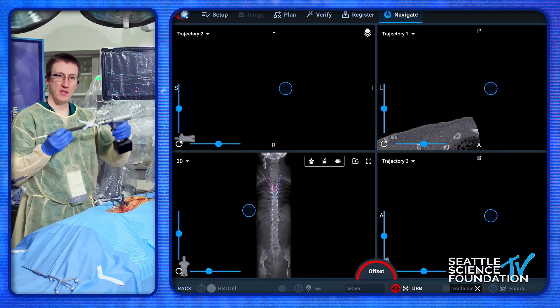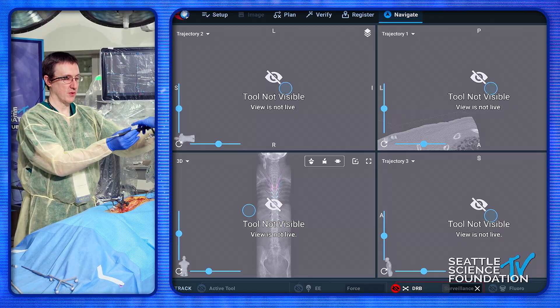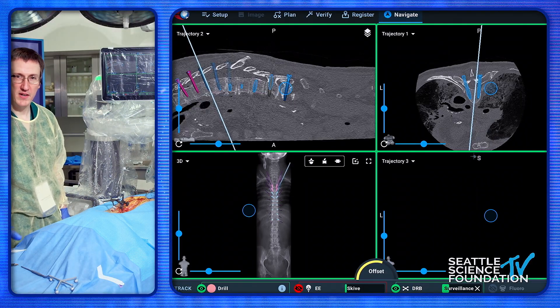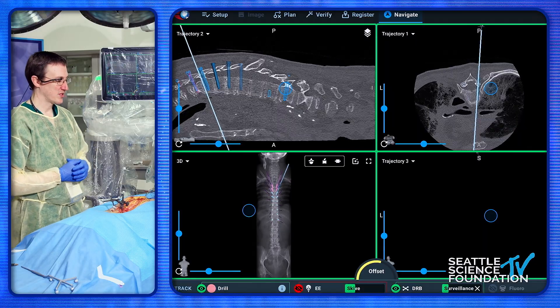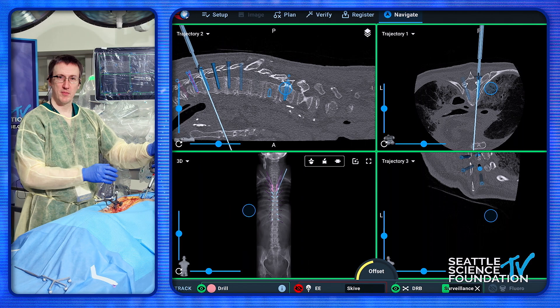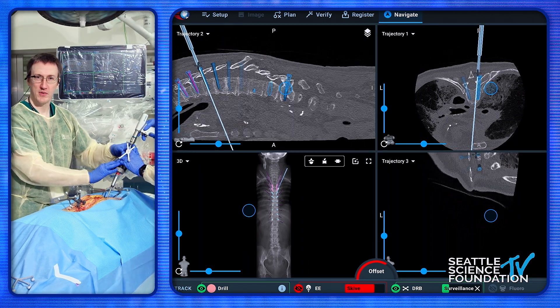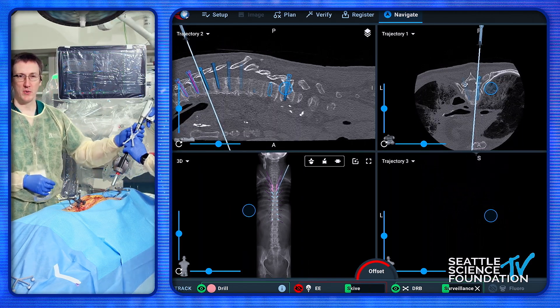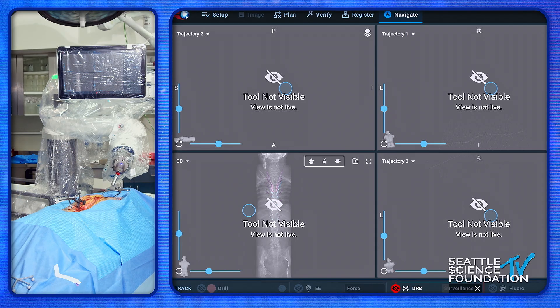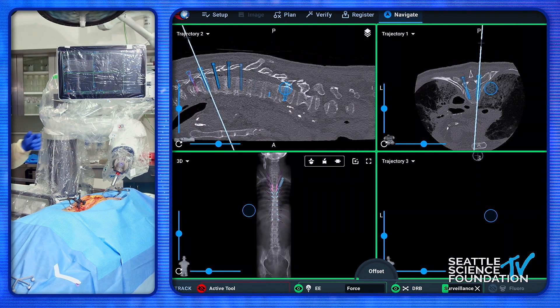If you have two instruments in the camera field, the computer can get confused, so your techs are going to place them down. We want to keep the balls dry so we don't suffer any changes there. Now, if for some reason somebody carelessly — the attending, curiously — comes in and pushes the robot away, we can always remove the instrument, cover up the balls, press the foot pedal, and redirect the machine to get back to that perfect trajectory again.